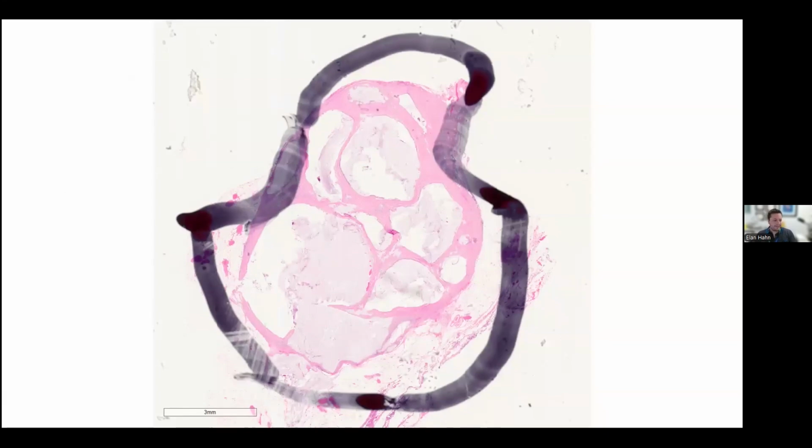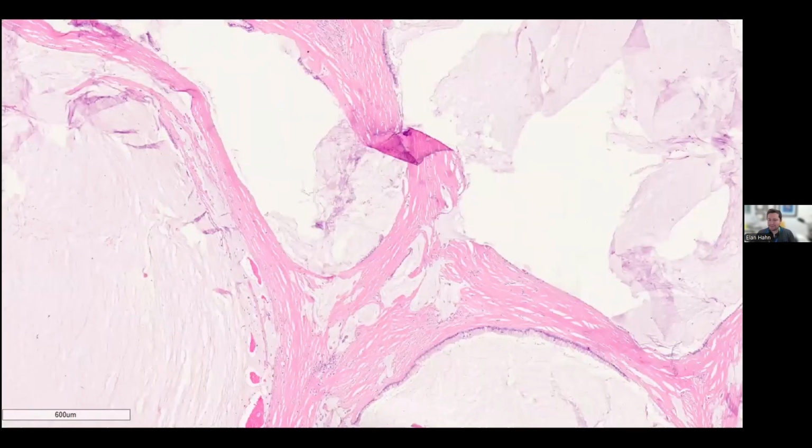trying to get rid of some lymphocytes, as you can see at the periphery, if you could see through the marker. There's some lymphocyte aggregate here that could really dampen the allele frequency, especially in a case with such low tumor cellularity. So you can see it's mostly mucin, which happens to inhibit PCR as well. And there's just scant strips of tumor epithelium.